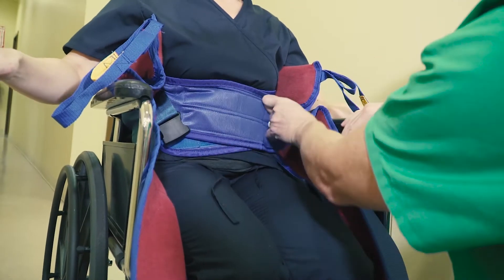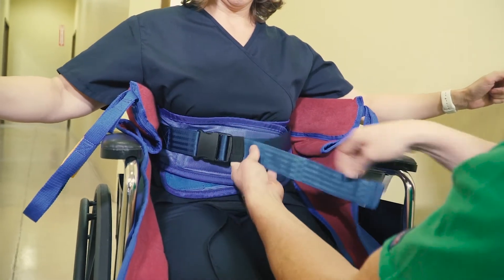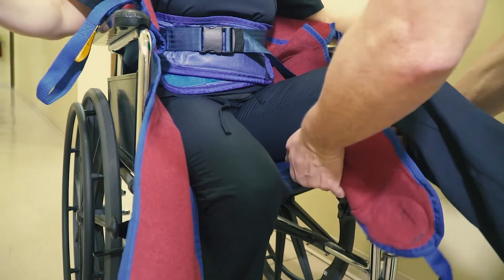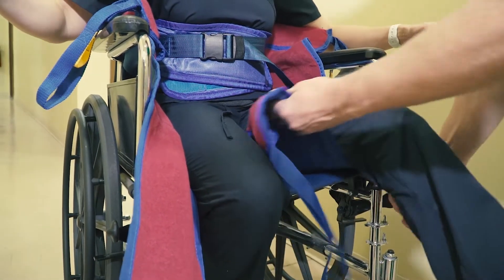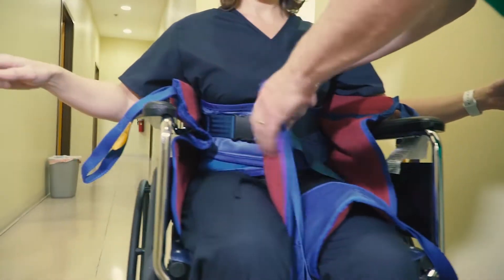Connect the support belt and safety buckle, making sure that it is snug but not too tight. Position yourself in front of the patient and gently raise each of the patient's legs to pull the straps underneath and over the patient's legs. You want the straps to be mid-thigh on the patient for the most comfortable transfer.